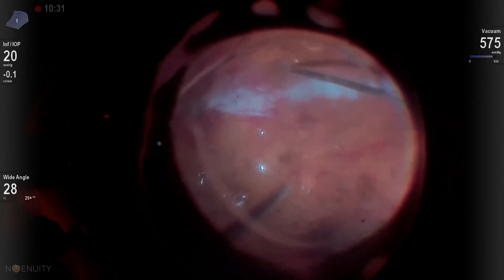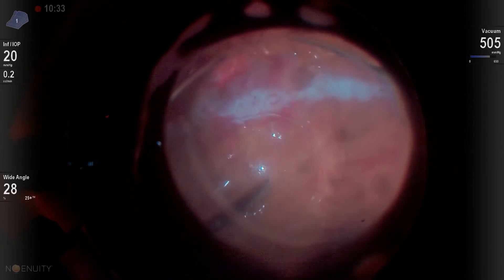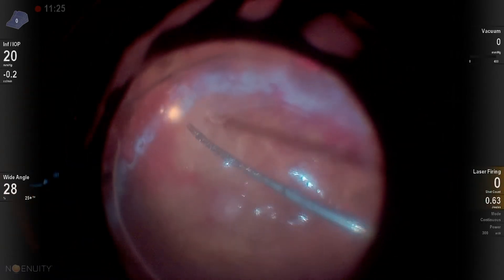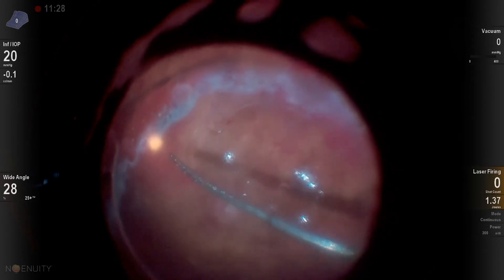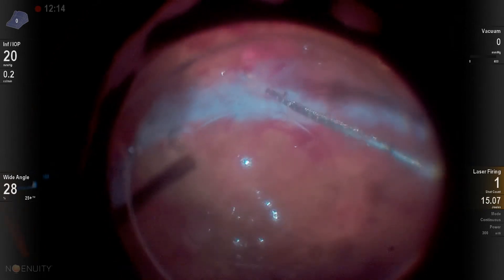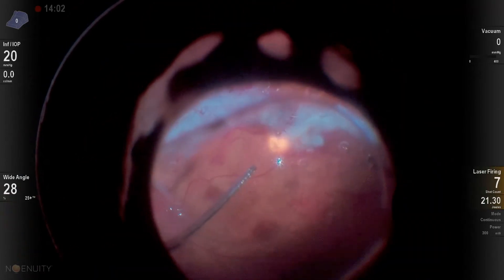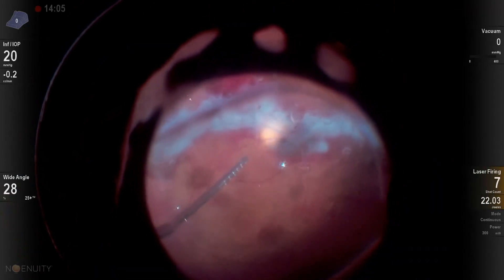Here you can see I'm utilizing the soft tip to just aspirate — kind of drag that retina out and try to straighten it out a little bit more. Then I use the endo laser on continuous. Many times I'll retinectomize further away than where my diathermy is, and I'll laser that retina.